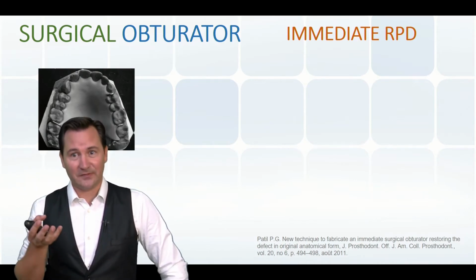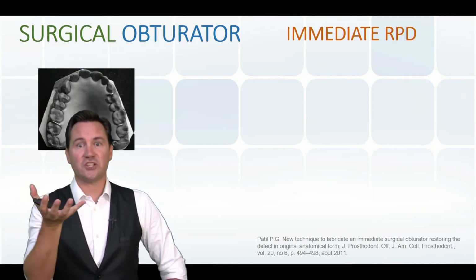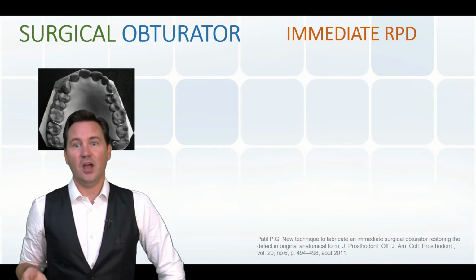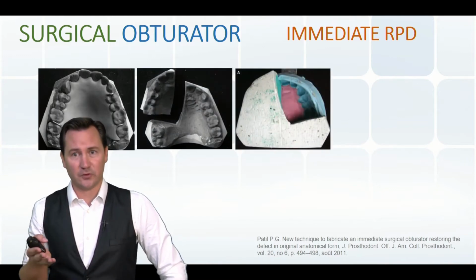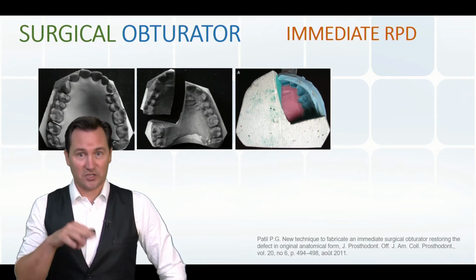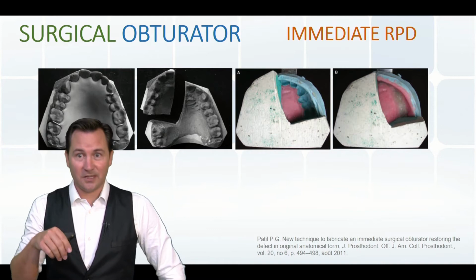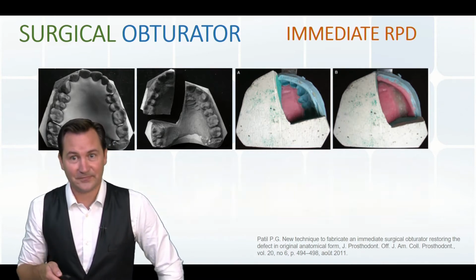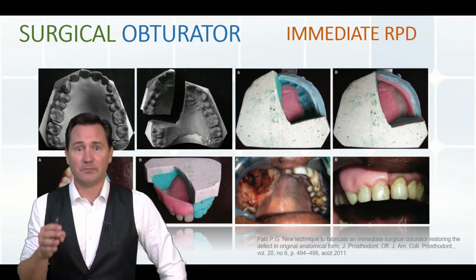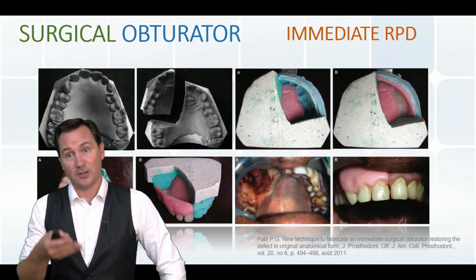This plate was then fitted in the mouth during the second appointment, and they took a wash impression of the plate in the mouth. On this new cast, they removed the plaster corresponding to the future defect, put back the impression on the plaster, and poured dental resin for the teeth and then pink resin for the gum borders. And this way they have a cheap denture for support, but requiring 2 appointments and lab time.